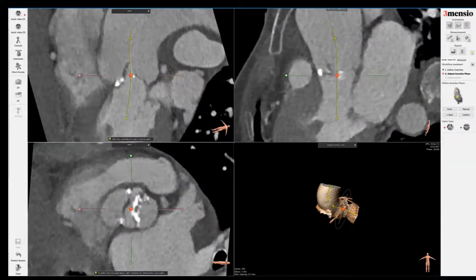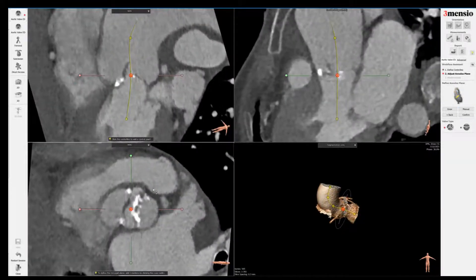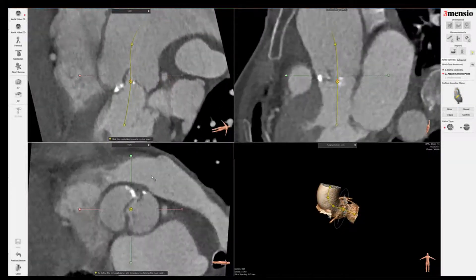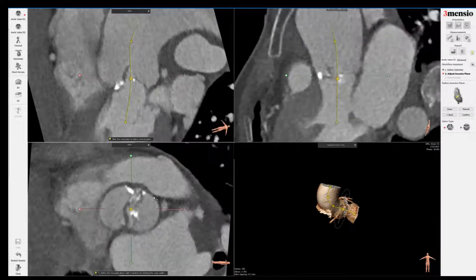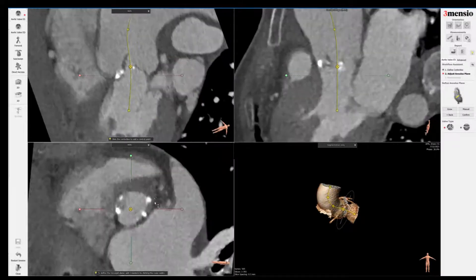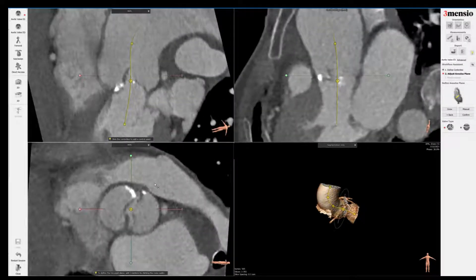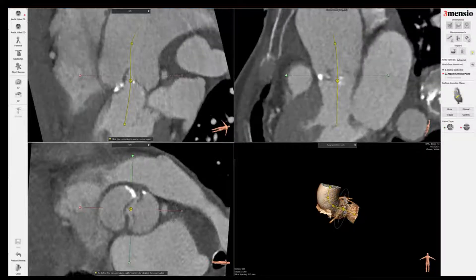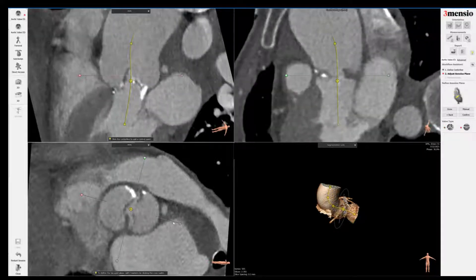Here you can see a type zero morphology of a bicuspid valve. You go to the right side and click the bicuspid icon, which is typically used for type zero. If you're type one, you can still use the free leaflet icon.